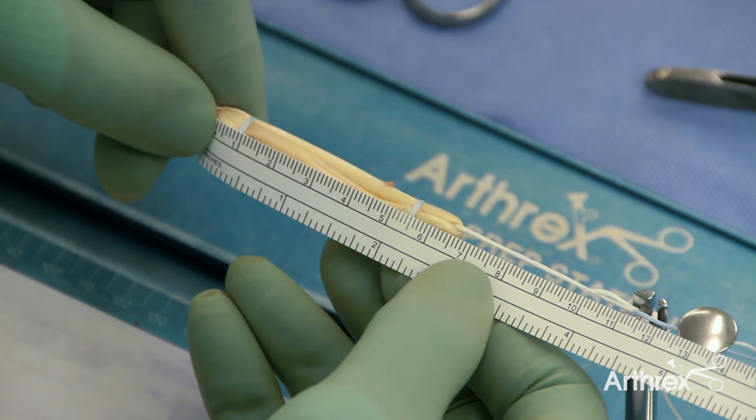So our graft is now prepared, and you can see here it is measuring 68mm, which is very typical and more than adequate for the all inside reconstruction. We have a minimum of 20mm for the femoral and tibial sockets and 25mm for the intra-articular portion.